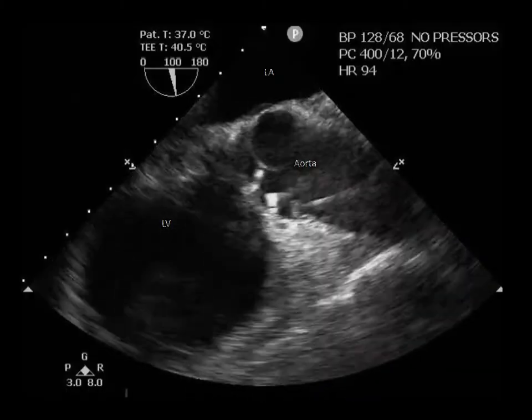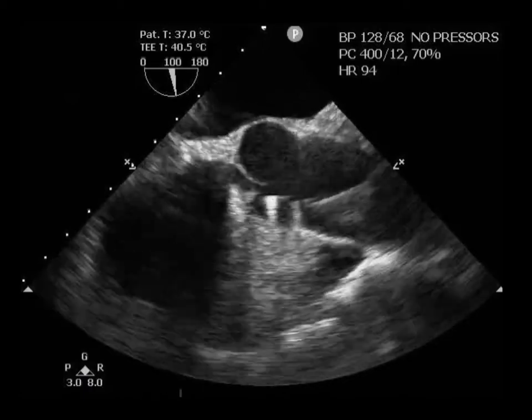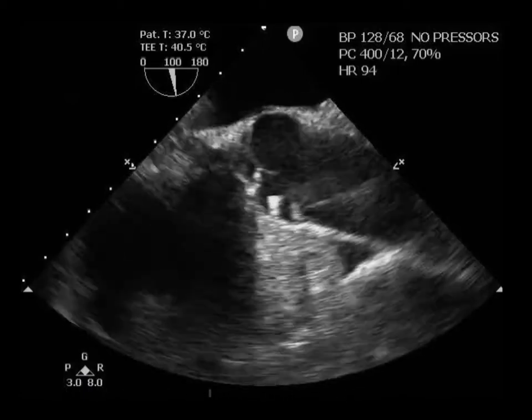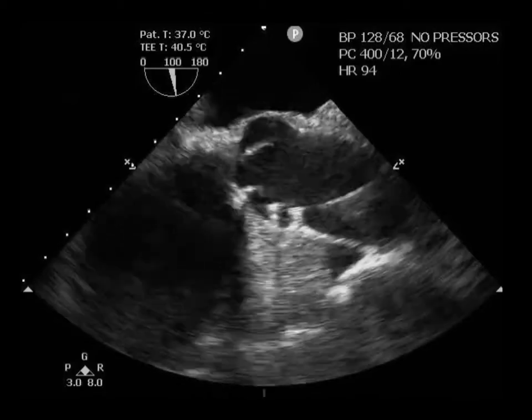Unfortunately, the wire is not always where you want it to be. This is an example where the wire had gone through the posterior wall of the jugular vein, through the carotid artery, and was in the aorta. And obviously, it's very important that you pick that up before they start the dilation.